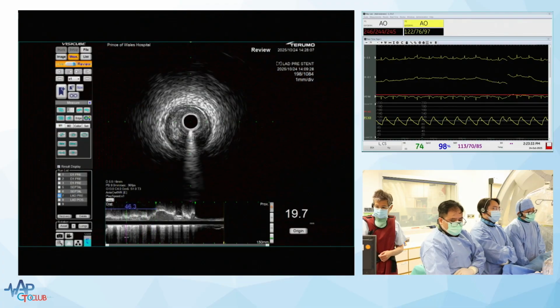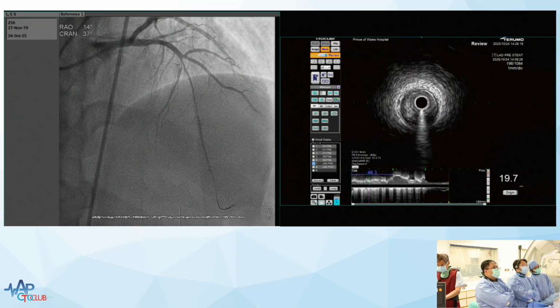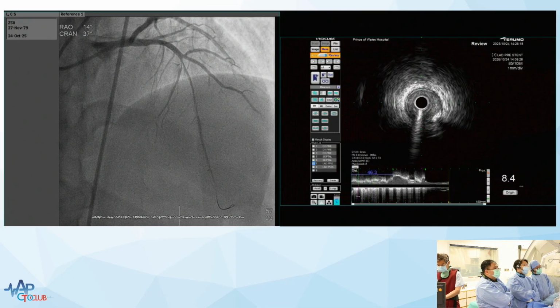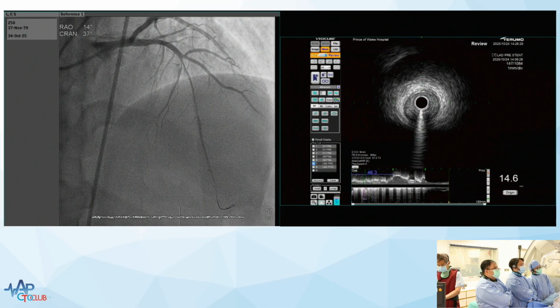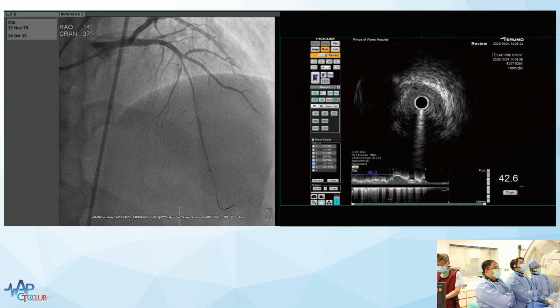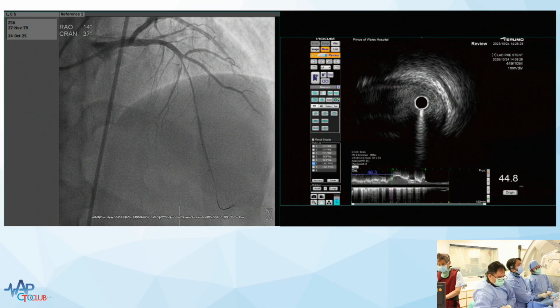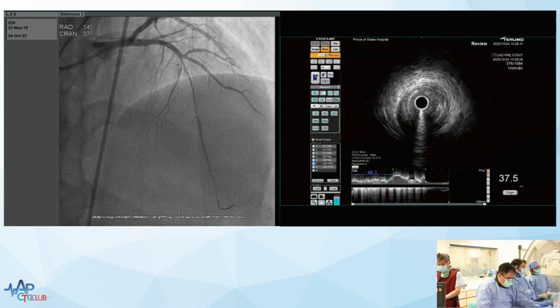Sarah, what would you do? Given the fact that you're going so fast here, I would also IVUS the diagonal, purely just to take that box off, to make sure the diagonal looks okay. And just DCB over the CTO segment, and the rest of the distal vessel is going to grow. I probably wouldn't put a 48 millimeter stent in, with all due respect. I'd just DCB the CTO.